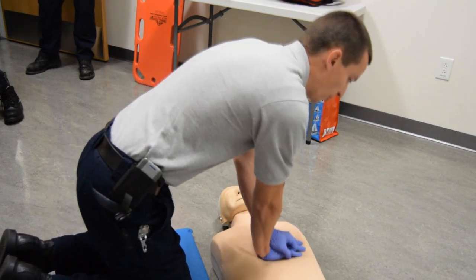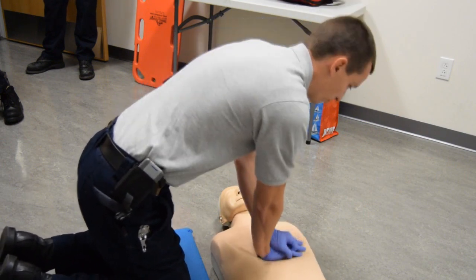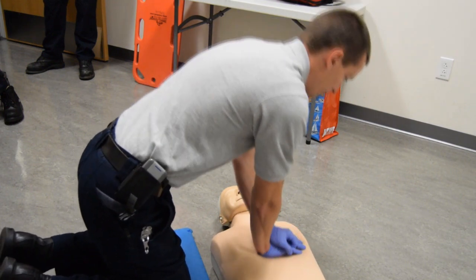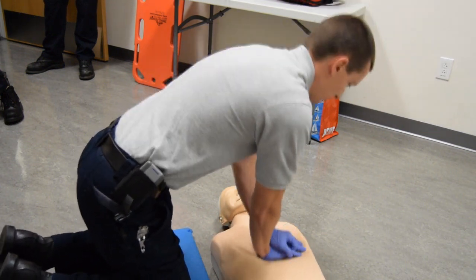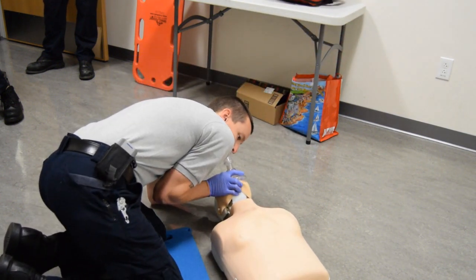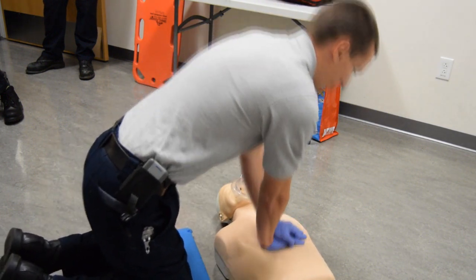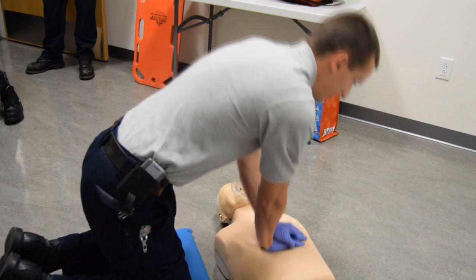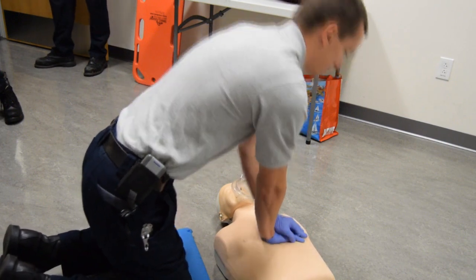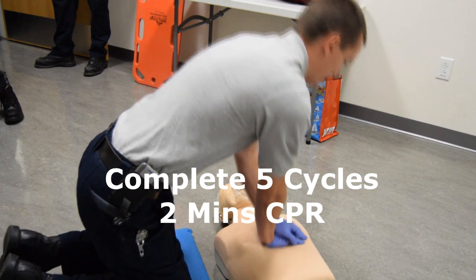The candidate performs two minutes of high quality one-rescuer CPR, ensuring adequate depth and rate, correct compression-to-ventilation ratio, complete chest recoil, adequate ventilation volumes, and minimizing interruptions to less than 10 seconds throughout. Compressions are counted aloud: 1, 2, 3... through 30.